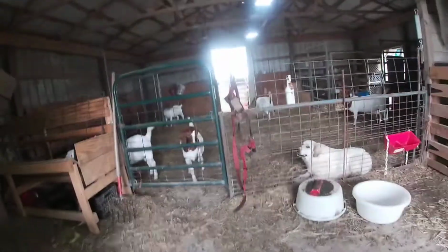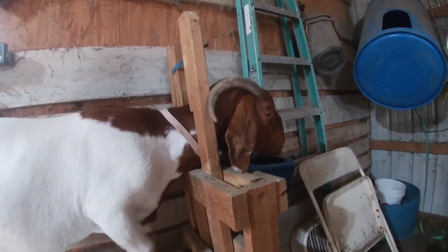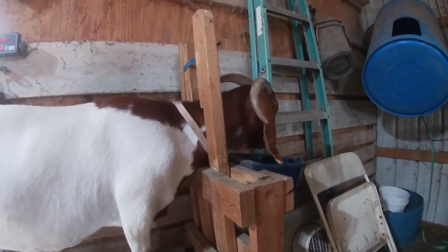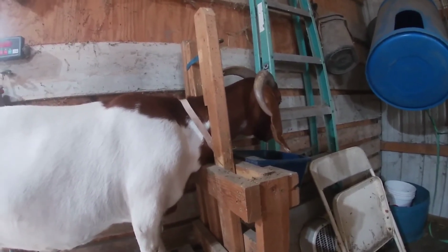And that's all there is to that. So she has stood up here and ate her alfalfa pellets while I put a CIDR in her, because she's old. She'll be 10 years old coming in March, and she just didn't cycle with the rest of the does.